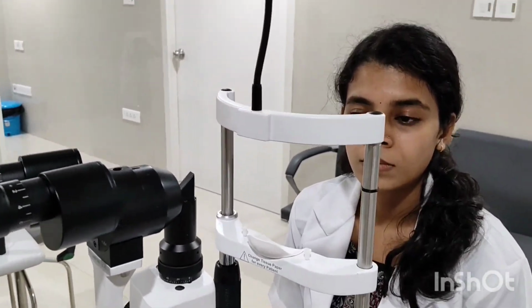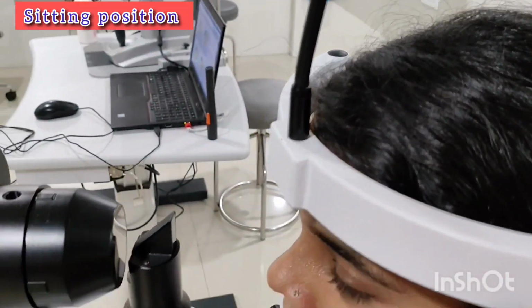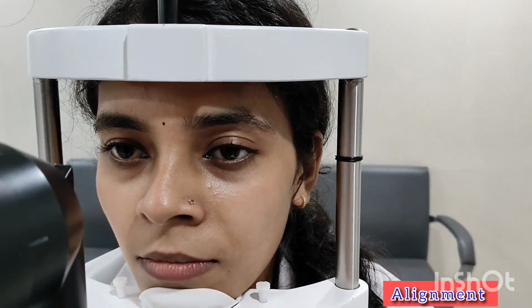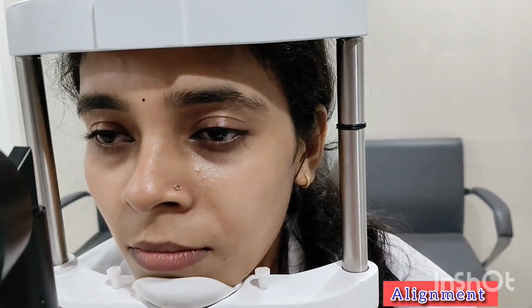We need to keep the chin and forehead properly. As you can see here, the forehead is not kept properly. Similarly, check for the patient sitting position. The slit lamp rubber markings should coincide with the outer canthus of the eye. For that, we need to adjust the knob and align it properly before examination.